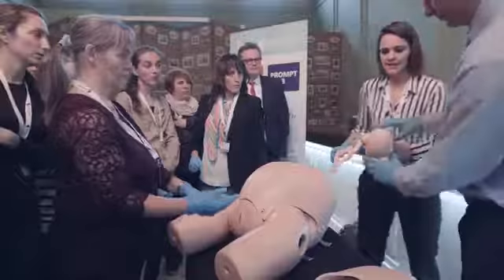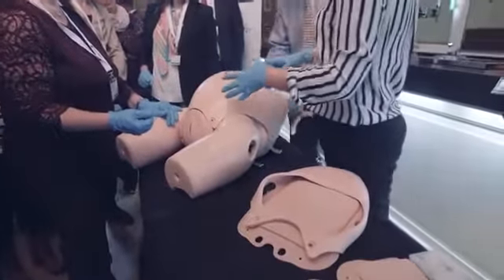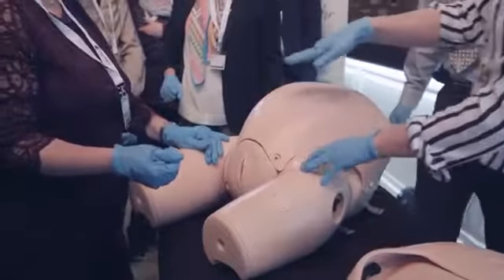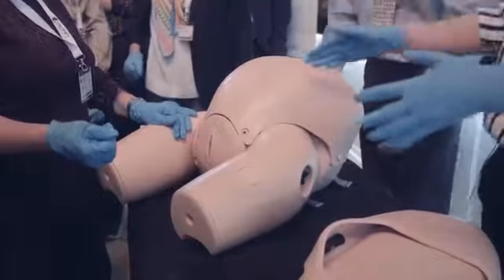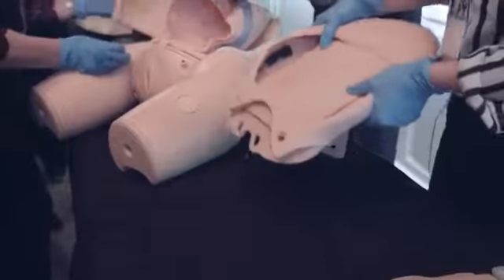I'll give you that, Nick, and just come over here. So I think if you're concentrating on one thing, like deeply impacted fetal head, it's good to keep it simple and just use this skin. But particularly for more junior trainees, if you want to teach the whole caesarean section from knife to skin to closing as well, there are these caesarean section skin modules.